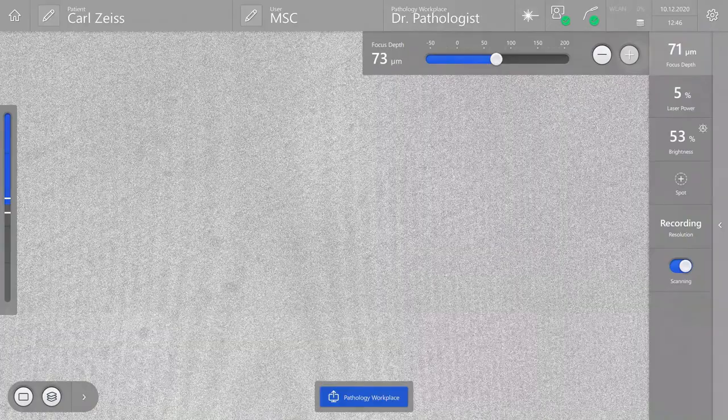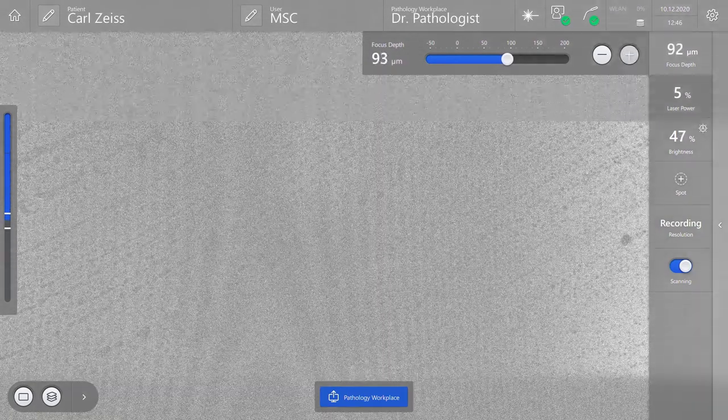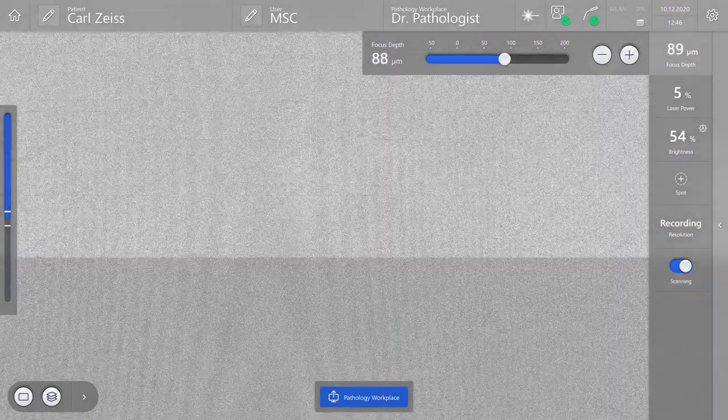In order to correctly use the ZEISS CONVIVO surgical workplace, the focus point of the ZEISS sterile sheath must be set before using.